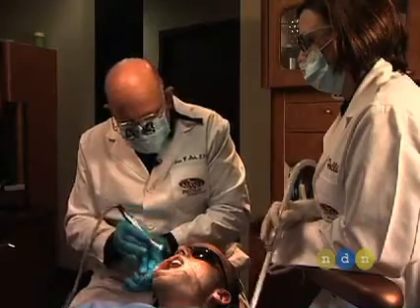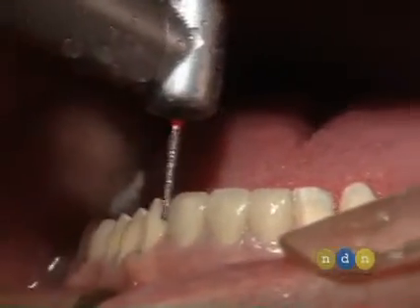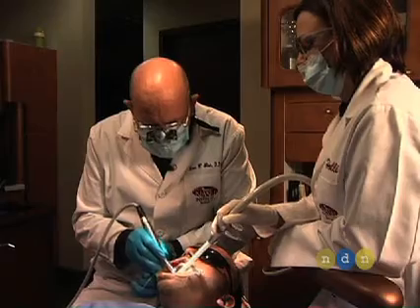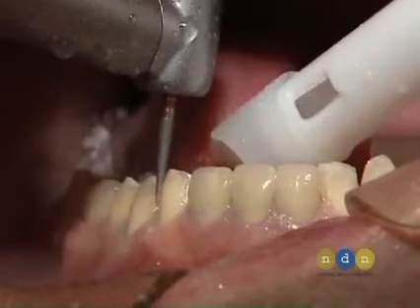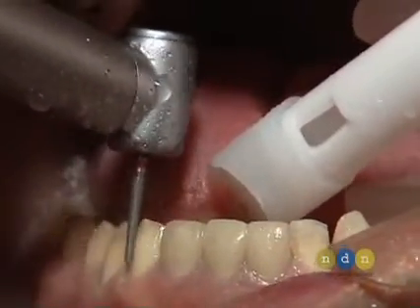Now we want to take this chamfer into the interproximals to form what's called the elbow preparation. Keep the burr along the long axis of the tooth so that you don't create undercuts as you form that elbow preparation.